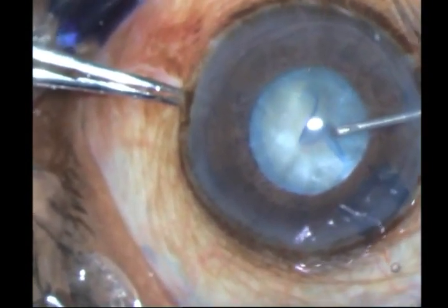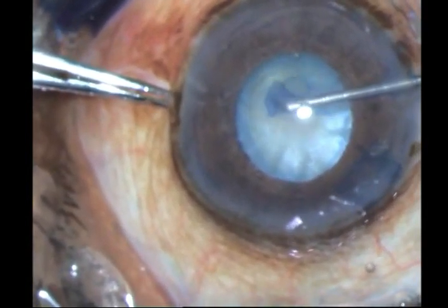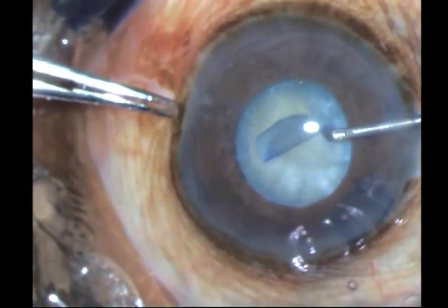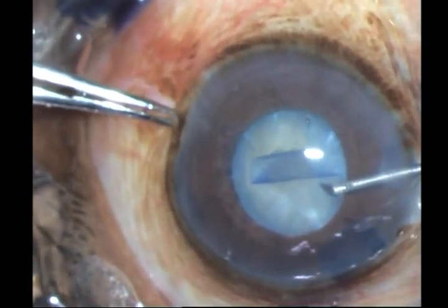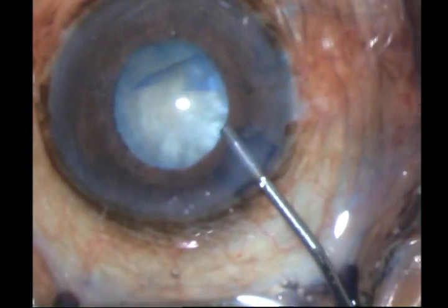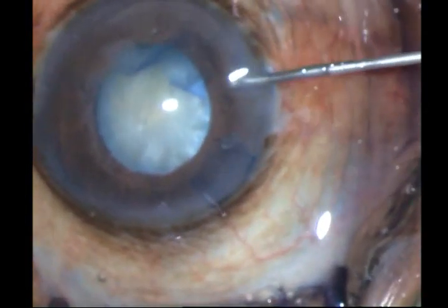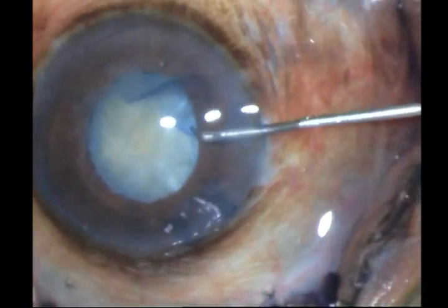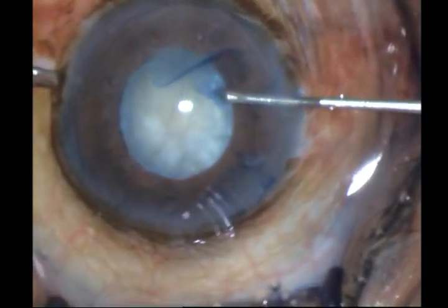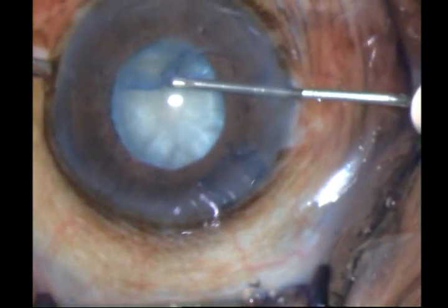Here I have gone ahead and performed maybe a sub-5mm rhexis. At this point I do not want to continue because it's risky, so I come out, put in more viscoelastic, flatten everything, and then again take my cystitome and complete the rhexis. You could take the Utrata forceps as well, but since I have only HPMC, there is a higher chance of losing the anterior chamber.